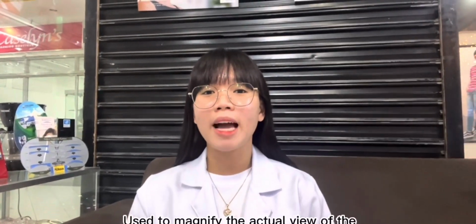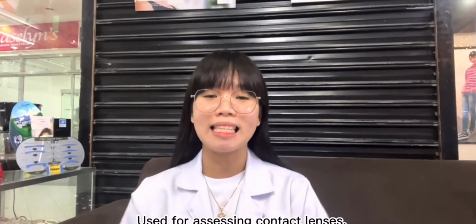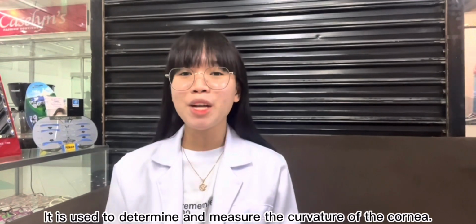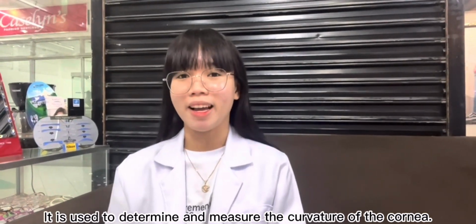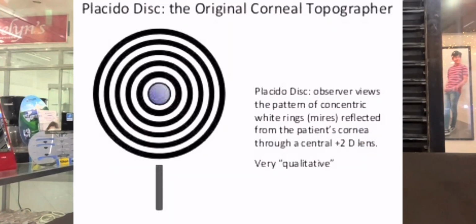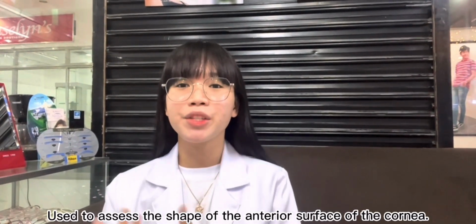Slit lamp or biomicroscope. Used to magnify the actual view of the anterior and posterior portions of the eye. It is also used for assessing contact lenses. Keratometer or ophthalmometer. It is used to determine and measure the curvature of the cornea. It is also derived from the placido disc. Placido disc. Used to assess the shape of the anterior surface of the cornea.